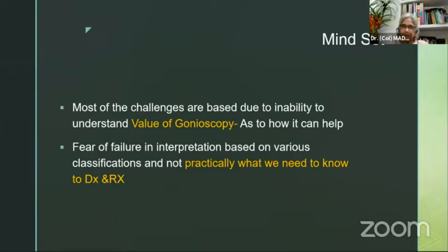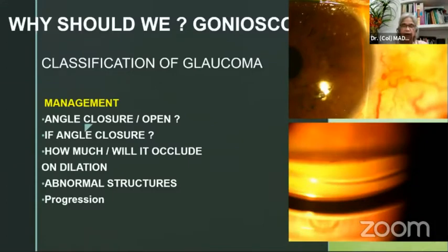So the moment a person understands the value of gonioscopy, it becomes automatically incorporated. All the hurdles are this thing. The fear of failure of interpretation is another thing which really comes in the way of multiple people who are very uncomfortable about doing gonioscopy. So, why should we do it?